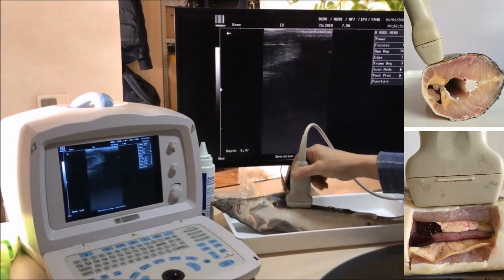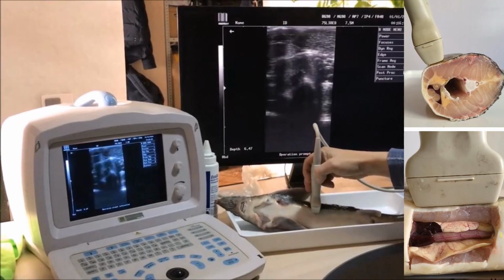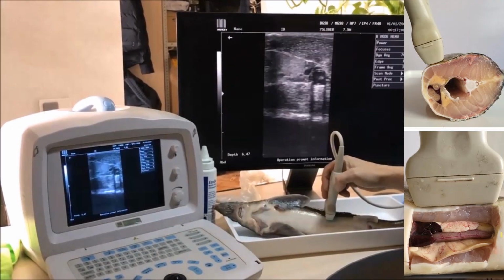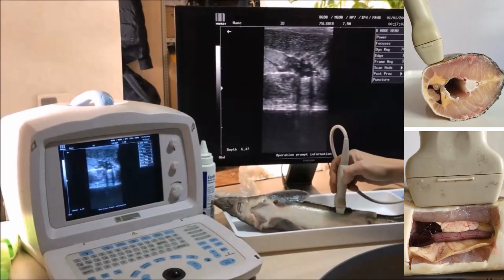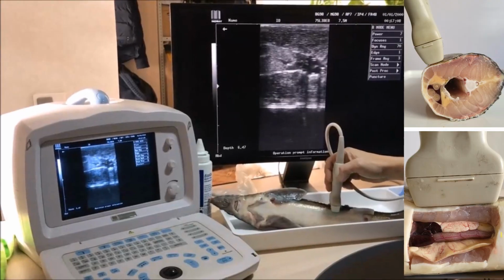This is done only for demonstration purposes, so that it was visible that the scanning area of the transducer is located at the edge of the body, and the transducer itself is located almost at right angles to the surface of the body. You can see on the scanner screens and the monitor next to it that the transducer moves along the gonad and there is no loss of the gonad. For full coverage of the entire gonad volume, the angle of the sensor is also changed slightly during the longitudinal movement.